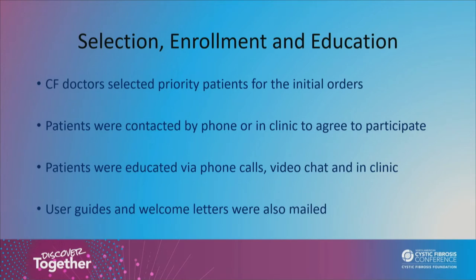So the way that the program was set up by the foundation is the spirometers went directly to the patients when they were ordered. So part of the large amount of work that the RTs had to do is we had to contact the patients prior to the devices ever being sent out. And the reason is because you want to make sure they want to do it. And we did have a small number of patients that said, we're not interested. We don't want to do it.